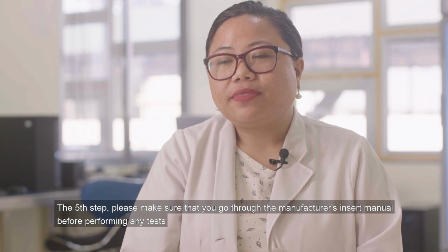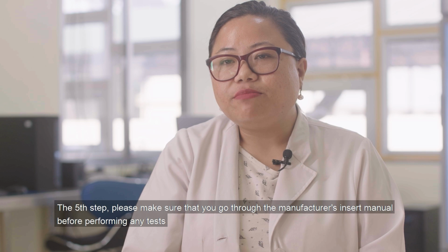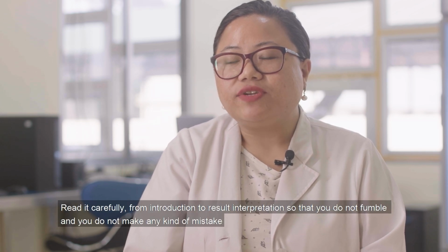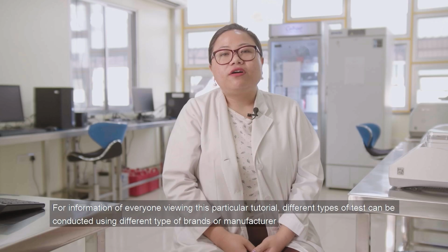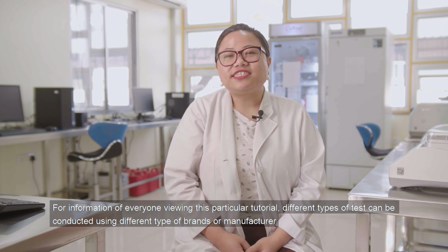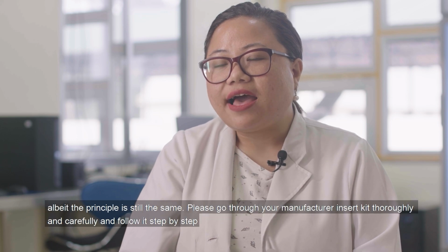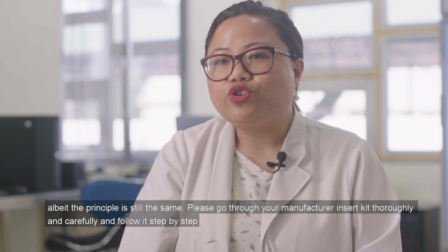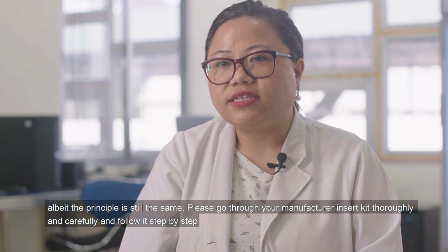The fifth step, please make sure you go through the manufacturer's insert manual before performing any tests. Read it carefully from introduction to result interpretation so that you do not fumble and you do not make any mistakes. For the information of everyone viewing this tutorial, different types of tests can be conducted using different brands or manufacturers, albeit the principle is still the same. Please go through your manufacturer insert thoroughly and carefully and follow it step by step.